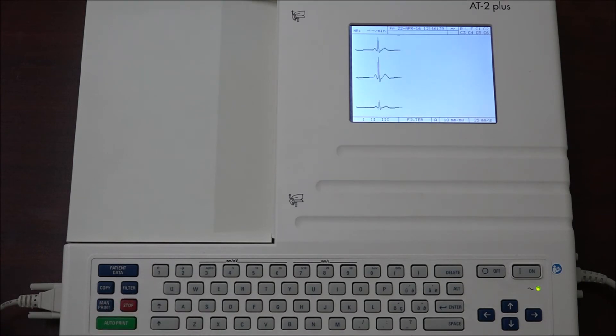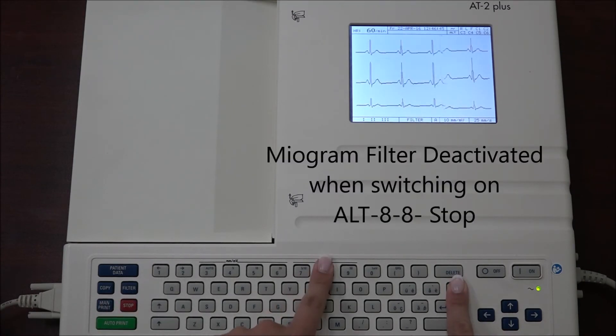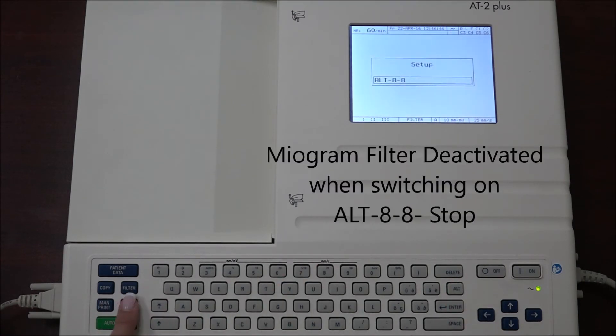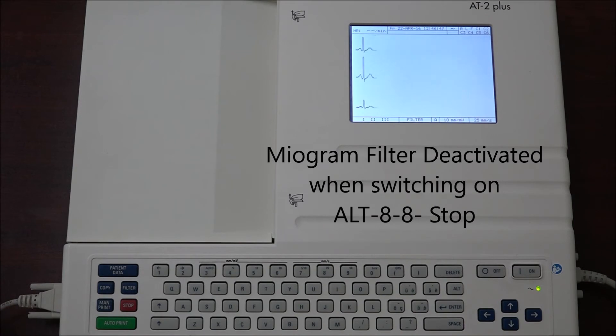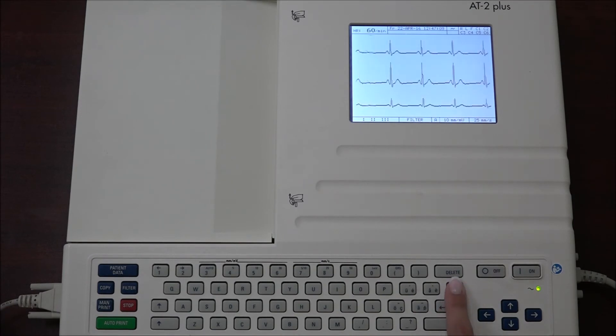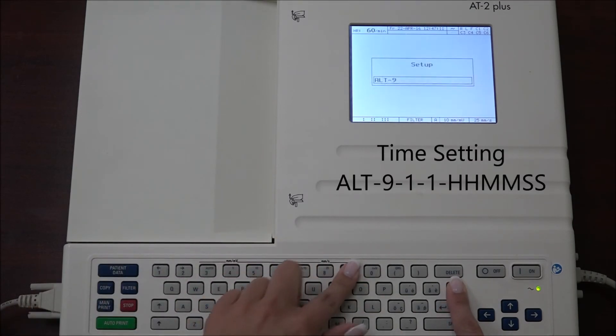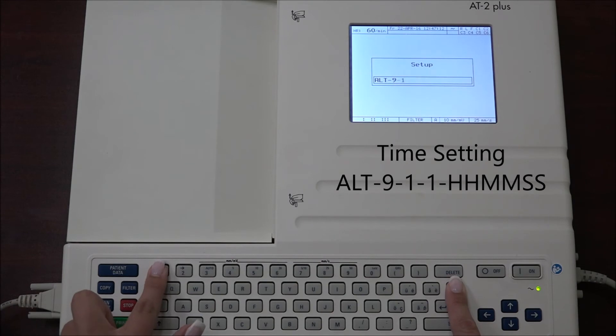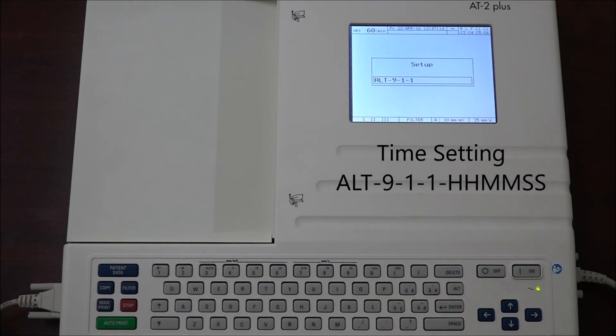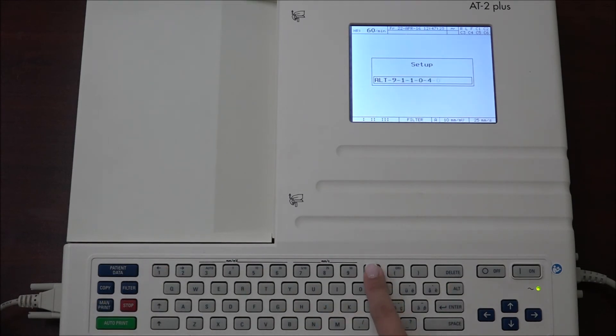To set the myogram filter off when the unit is first switched on, press ALT 8 8 stop. To set the time, press ALT 9 1 1 and input the hour followed by the minutes and the seconds. You will hear a confirmation beep.